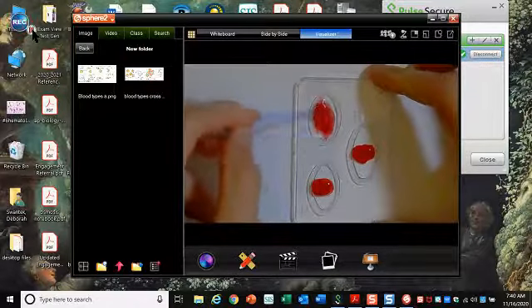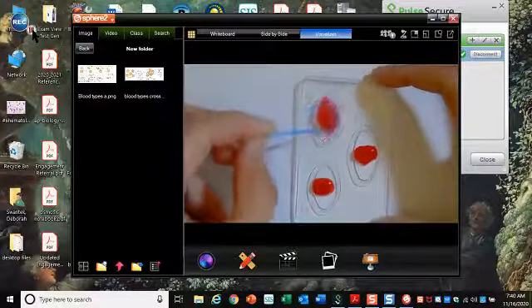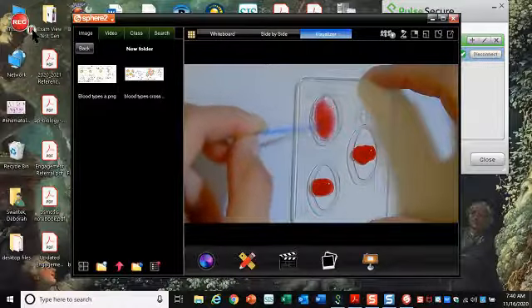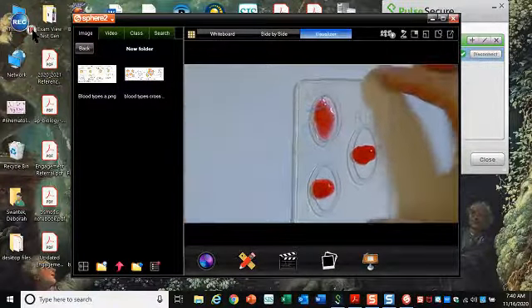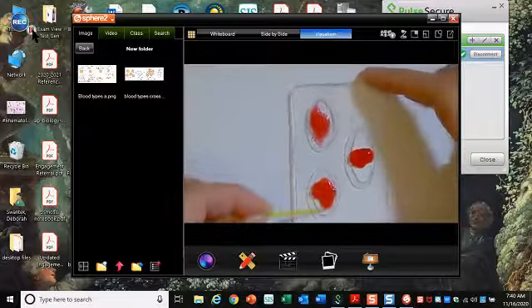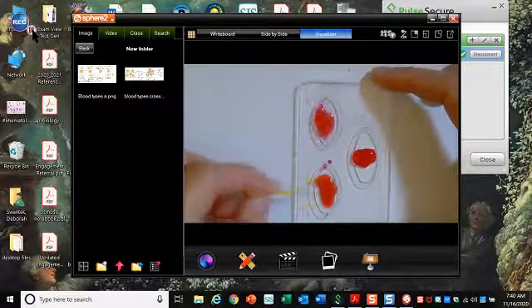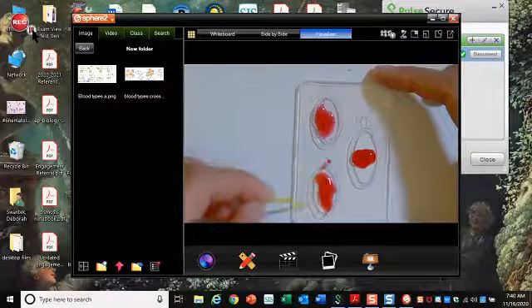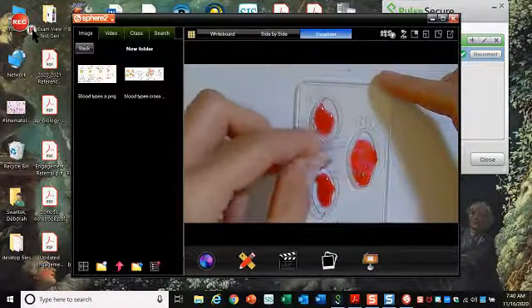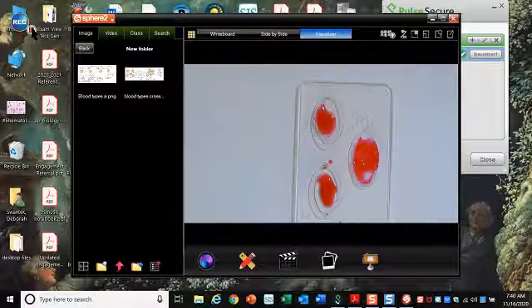I'm going to mix my samples. Okay, I'm going to let that sit for a minute.